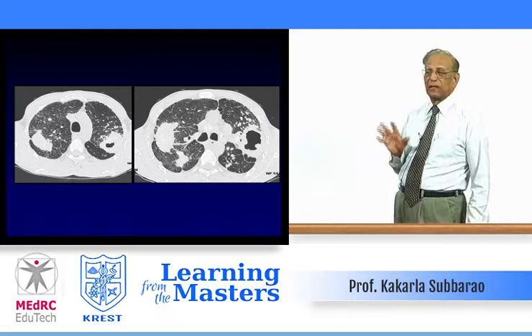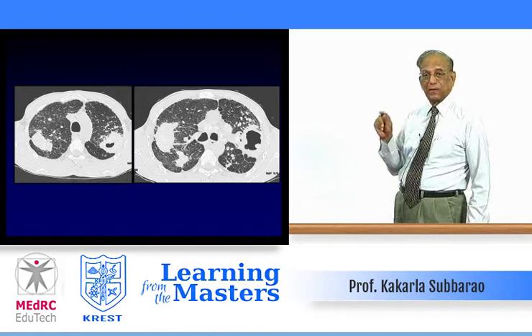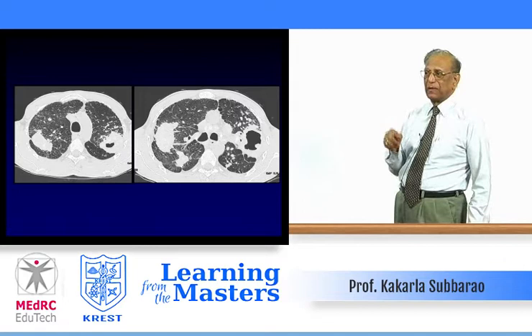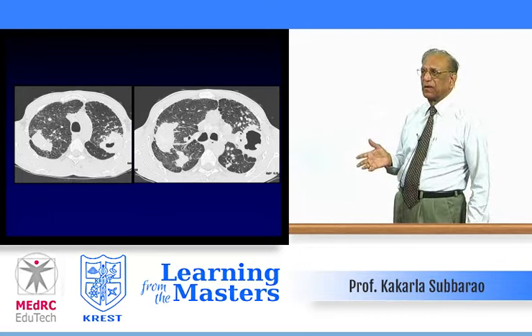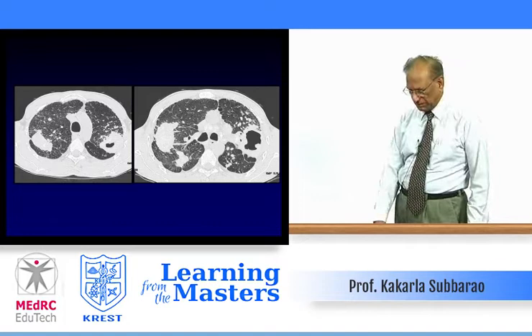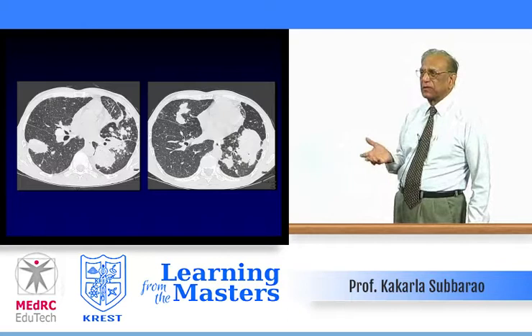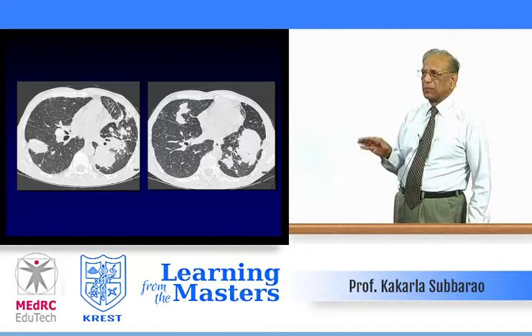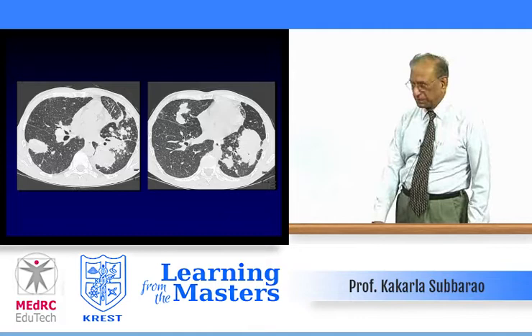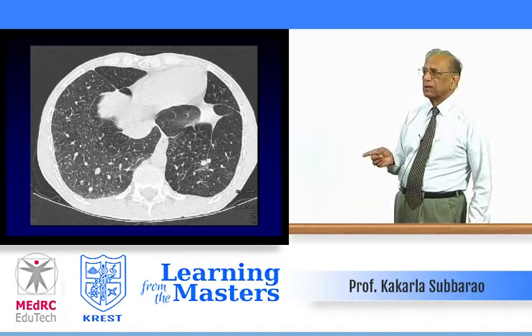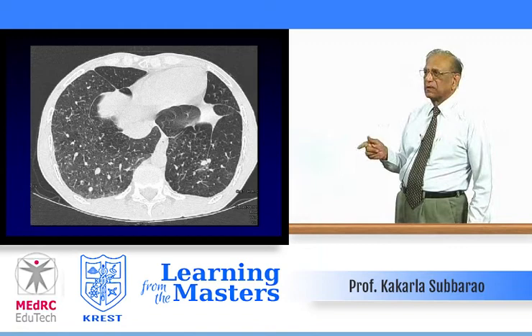CT high-resolution scan shows an irregular outline cavity in the left lung. On the right side, note that oblong opacity whose lateral border is parallel with the thoracic cage. Several interstitial nodules and changes are noted; in the hilum, nothing specific. Similar changes in the rest of the lungs, with interstitial changes predominant — nodules and some reticular changes. Another view shows thickened septae in the lungs, and the pleura are also thickened.